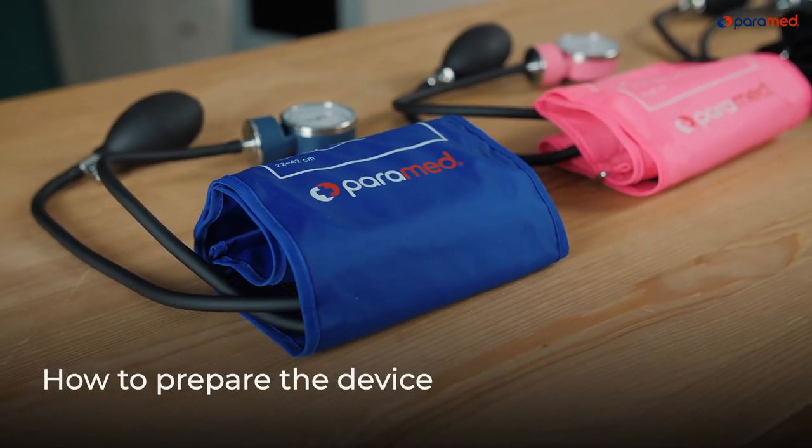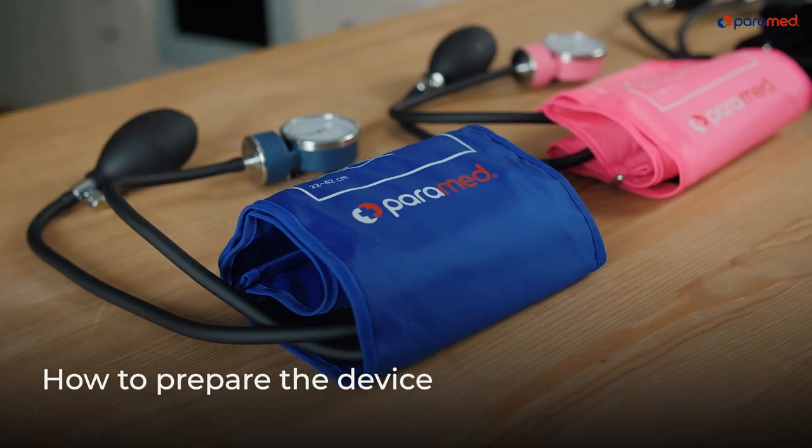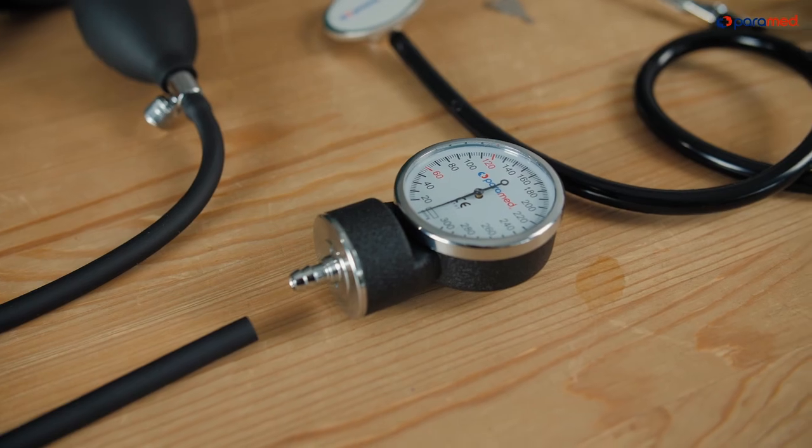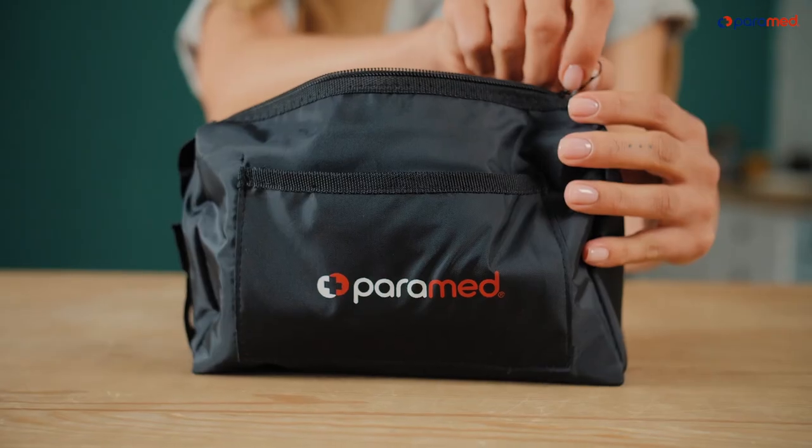How to Prepare the Device. A Sigma manometer is composed of a cuff with tubes, an air pump, a manometer, a regulation key, and a storage case.